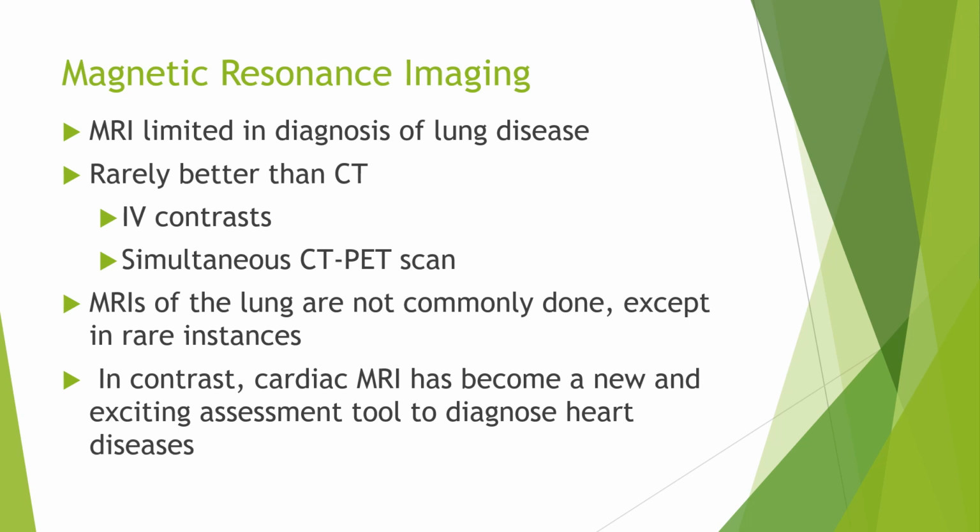So let's talk about MRIs. MRIs are going to be a whole different beast. Remember this one, the patient can't have any metal. You can't have any metal if you're going in there, especially if they're on a ventilator. This can add some complications. It's not too bad overall, but just remember your whole metal thing. Don't get the people in radiology upset with you.